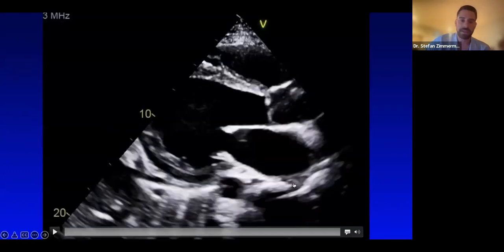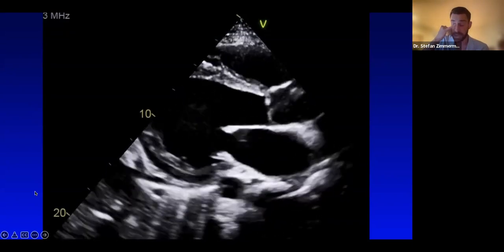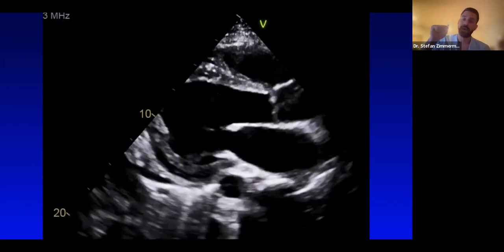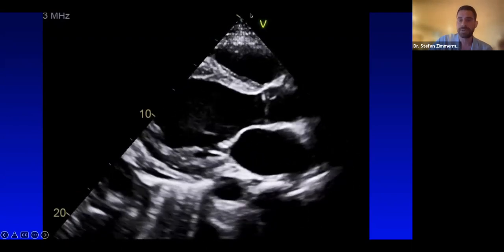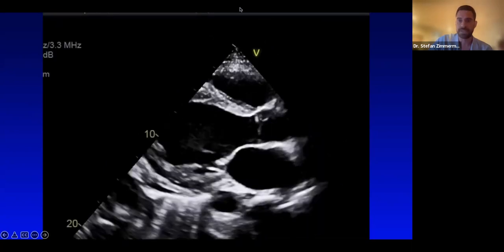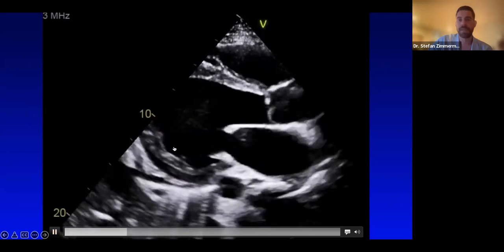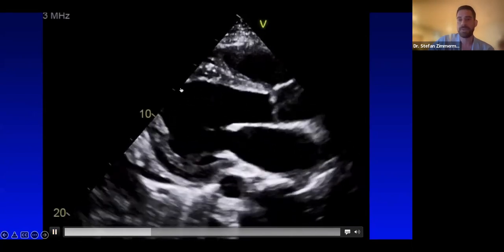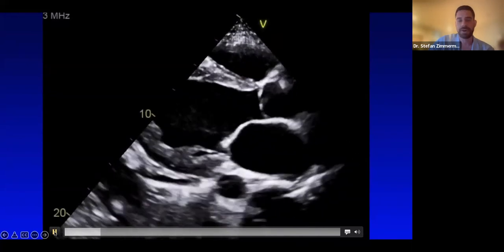So here's a set of images from an echocardiogram. So this is an ultrasound, like I mentioned. And there's an ultrasound probe that's put on the surface of the patient's skin up here. And then from that ultrasound probe, I'm having some video issues here, sorry. Let's try again. From the ultrasound probe, you get these images coming back from the heart itself. And those images basically show cardiac motion.